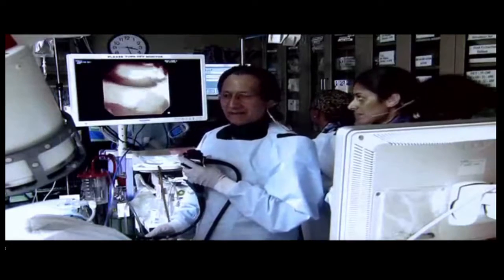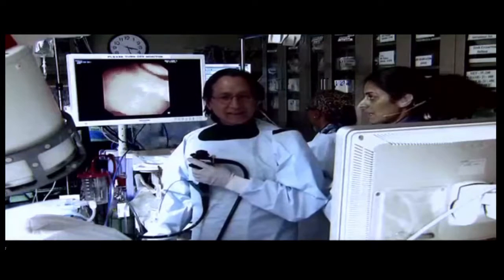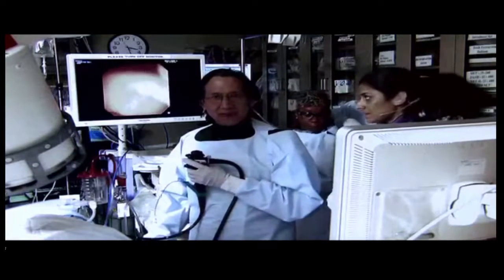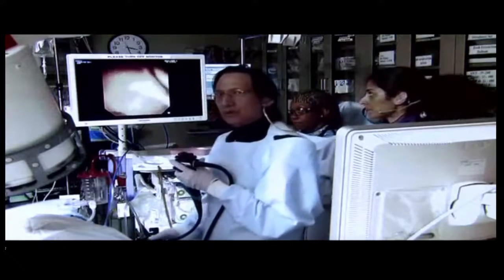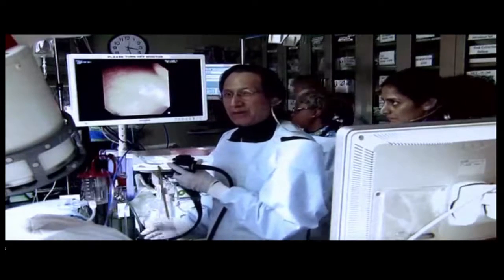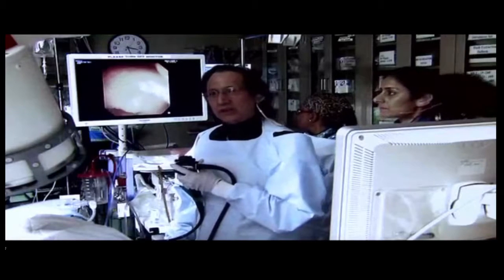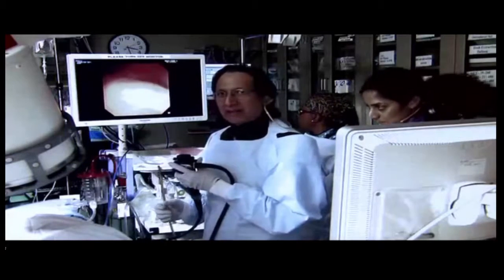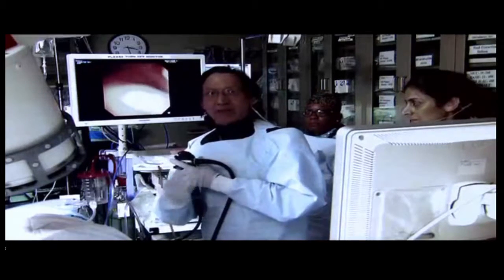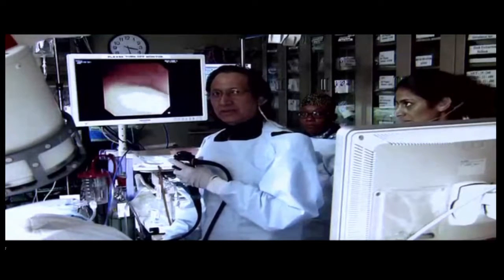So now we're down here. At the time I placed a covered metal stent, which we're looking at now. And the thought is to maybe do an EUS guided access into the pancreatic duct. Okay, good. So let's first take a look at the ampulla with the duodenoscope, and we have to remove this biliary stent as well, because if we're going to do an EUS guided rendezvous procedure to access your pancreatic duct, hopefully we'll be able to get our wire across, but we don't want that biliary stent blocking our ability to pass the wire across into the duodenum.